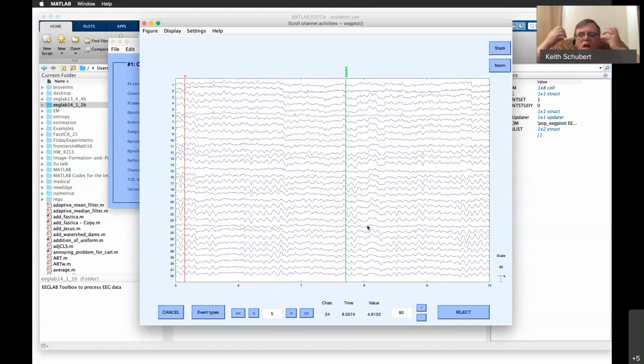There's just a lot of muscle activity connected to this area. So, wiggling the ears, all kinds of this type of facial action, we'll usually get a measurement in those areas. They tend to be fairly noisy. And so they're often right above the ears, right next to the ears, and are also used as a way to remove muscle activity on the brain from these different channels.